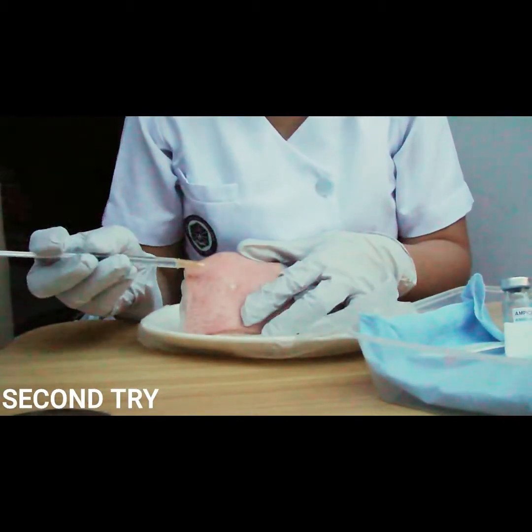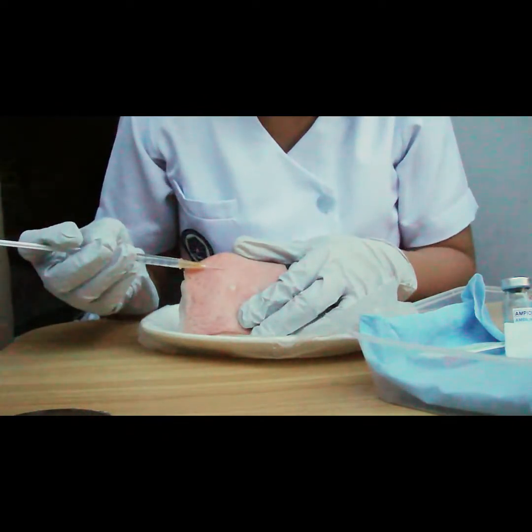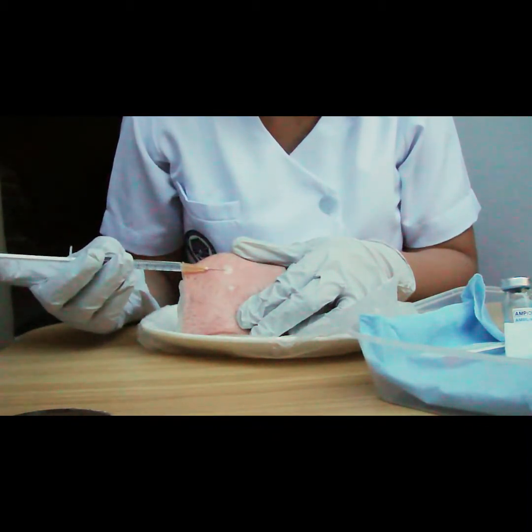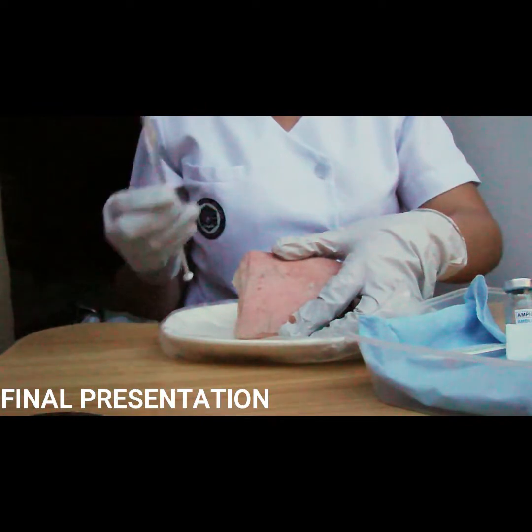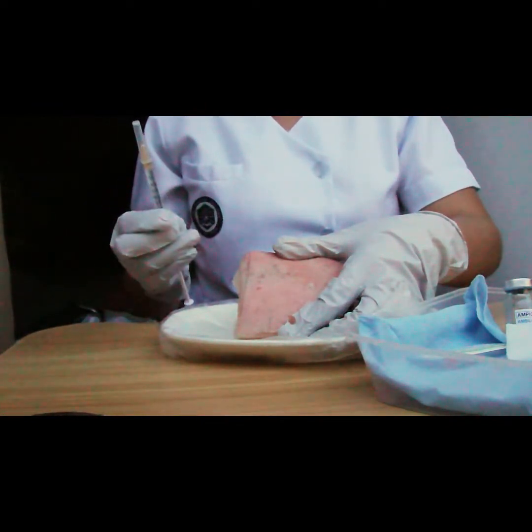So, again, bevel up. Grasp the syringe in your dominant hand, holding it between thumb and forefinger.